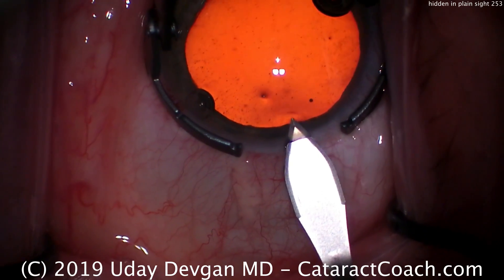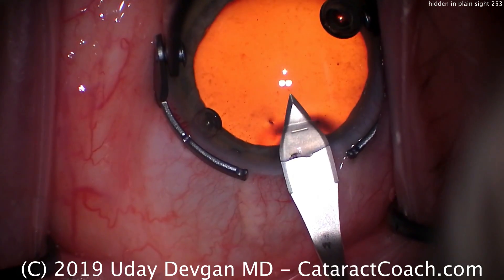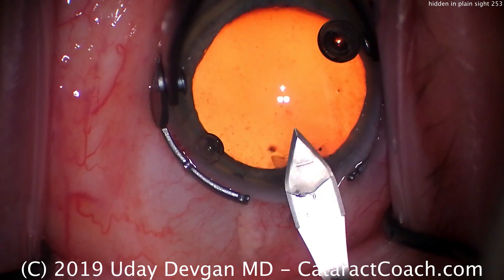Let me show you the steps of the surgery — we'll edit this video so it's quick. Here's the main incision, and that looks great, that goes fine. No issues, well constructed.